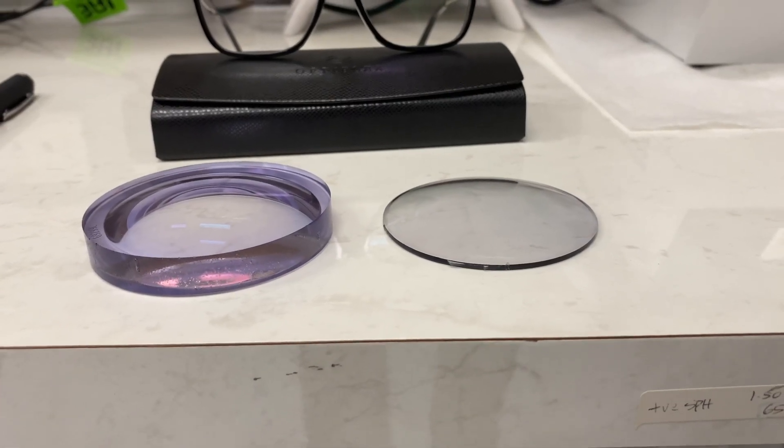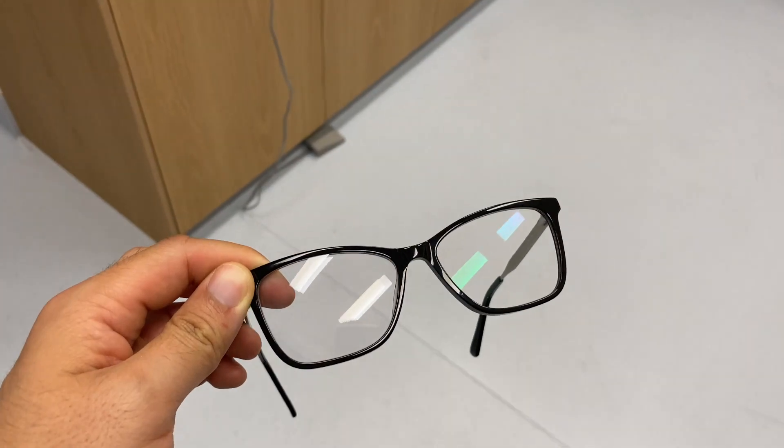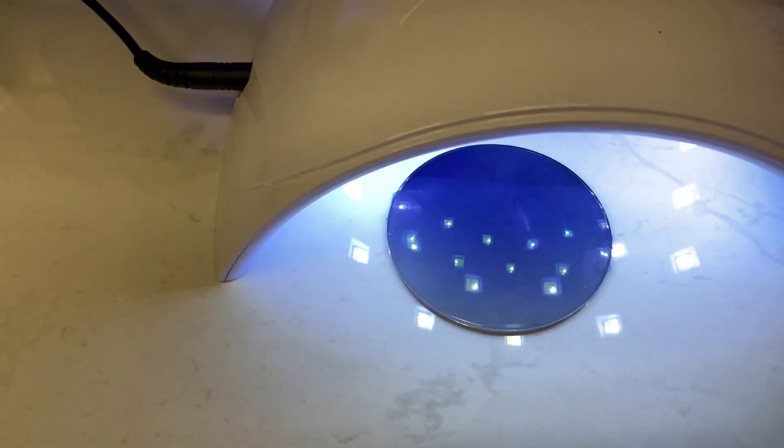Rachel explains that not all lenses are the same — customers can customize their lenses to their needs. They can make lenses thinner by choosing high index material, add blue light filters for computer use, add anti-reflective coatings to help cut out glare when driving, or choose photochromatic lenses that go dark when you're outside. Once everything has been selected, the order is sent off to a specialist lab and comes back in about seven to ten days.